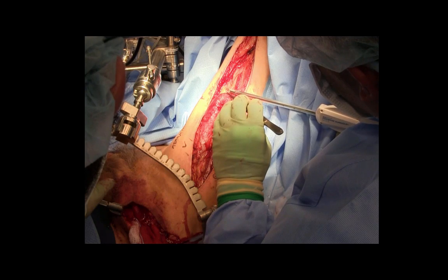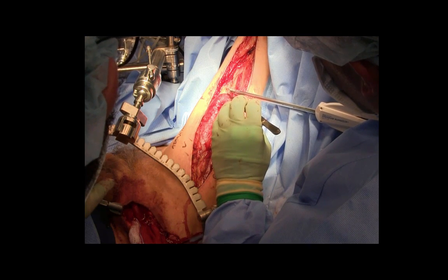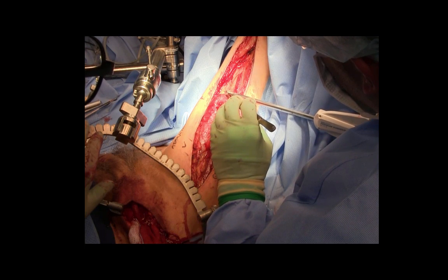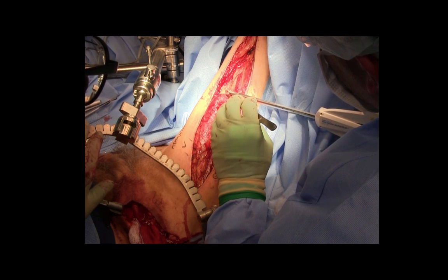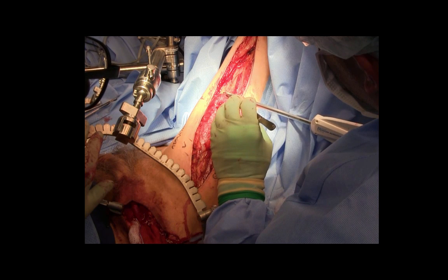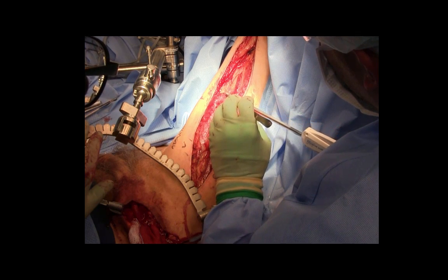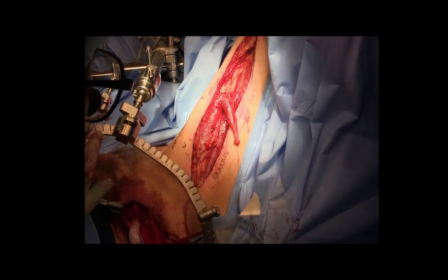Minor pedicles are identified distal to the main pedicle and clipped and divided sharply. Bovicautery can travel along a minor pedicle and destroy the longitudinal blood flow throughout the muscle — this is an important step.